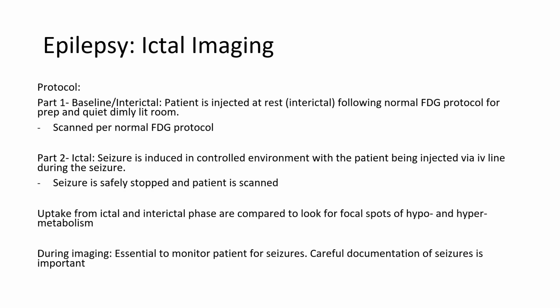They will not be scanned twice on the same day. They will usually be a few days apart, but they will be brought in and scanned in their hospital usually, and that's just the baseline. And then in their hospital room, typically, is where this occurs, they will induce a seizure.